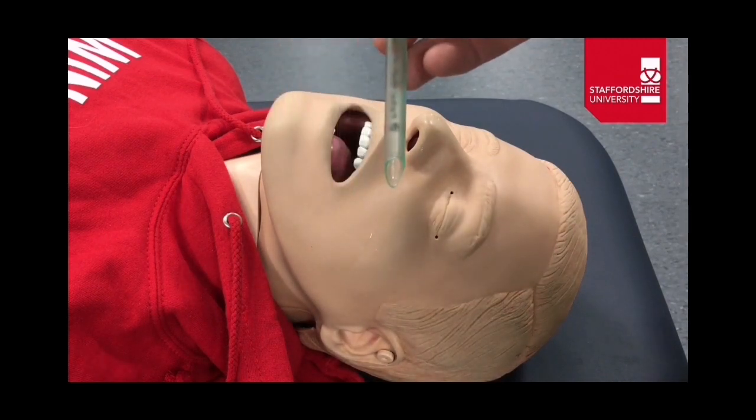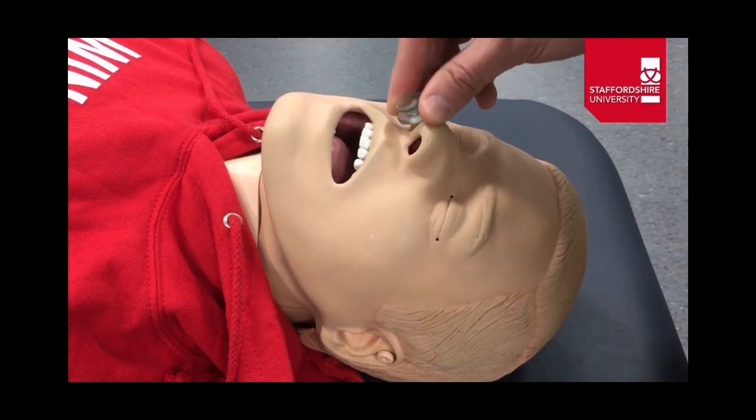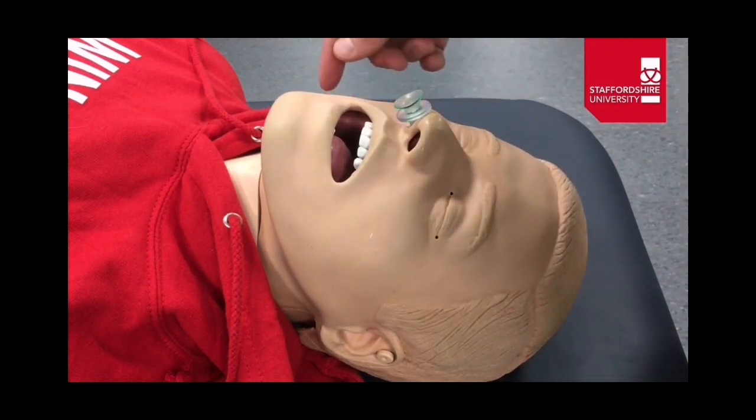Insert the NPA with the bevel, which is on the end here, facing towards the patient's septum. So in this case, if we go into the right nostril, facing the bevel towards the septum, we're essentially just going to push it vertically down into the patient's airway, allowing it to follow the anatomical curve of the airway.